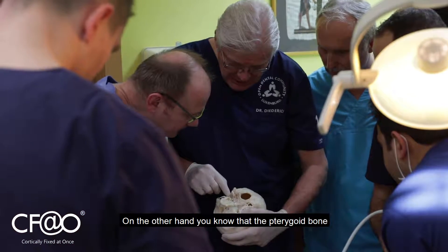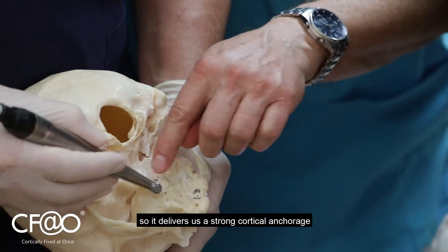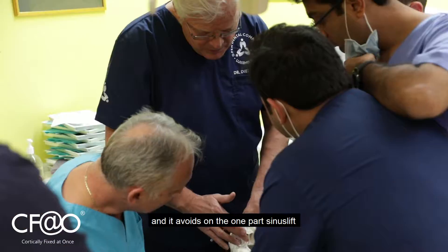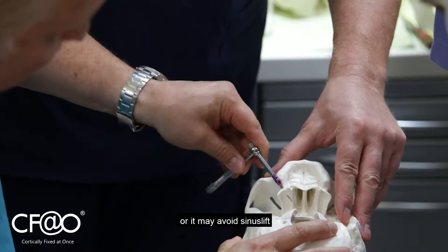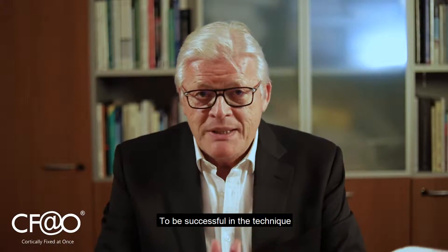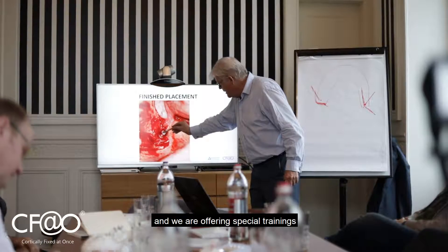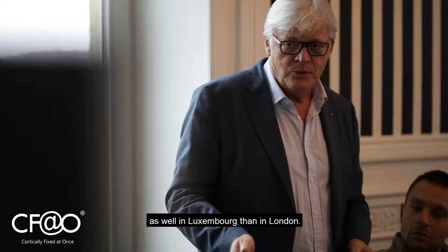The pterygoid bone is a very cortical, strong bone, so it delivers a strong cortical anchorage. It avoids, or may avoid, sinus lift and it avoids eccentric lever. To be successful with the technique you have to be trained, and we are offering special trainings in Luxembourg and in London.